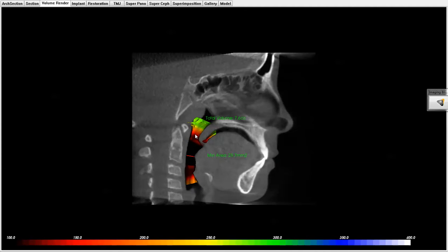If you'll notice there's some green area, a little more open airway, but look at where the big portion of the airway is behind the tongue — do you see how it's red and almost even dark black? So you can see this is a really constricted area of the airway, and the total volume on this particular airway is 7.6 cubic centimeters of air, which is pretty constricted.